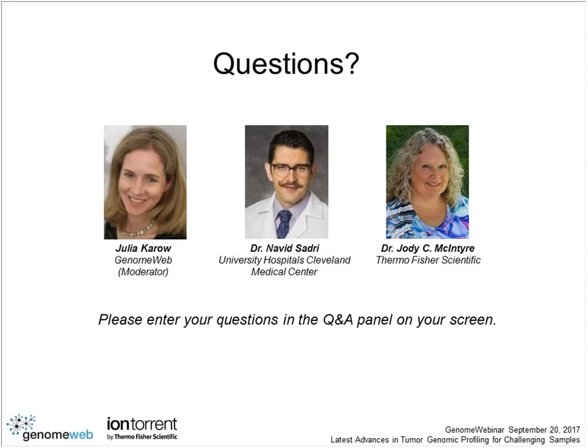Great, thank you. Dr. Sadri, very quick question. How many individuals actually work in your lab on this NGS workflow? We have normally one tech running the workflow. We have actually two techs running this, but we run a number of other cancer assays. So one tech normally handles this workflow, and we run this assay or some portion of this assay twice a week.